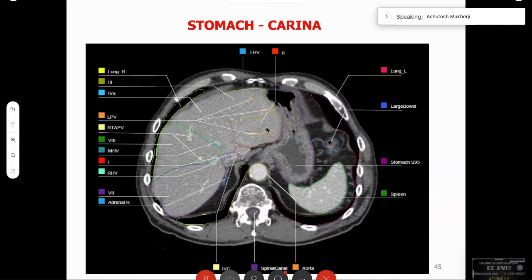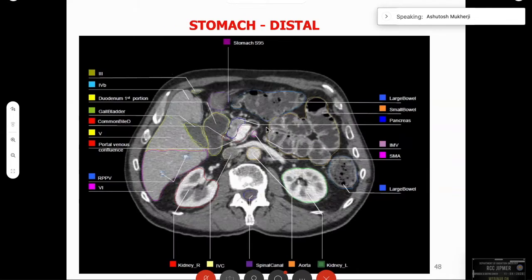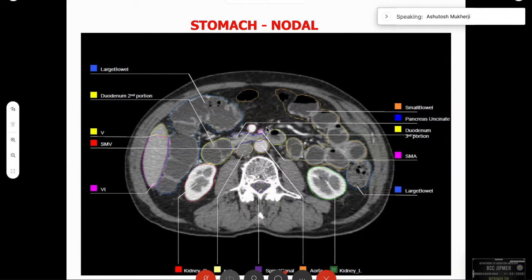There is a plethora of organs at risk near the cardia of the stomach and the proximal body of the stomach. As you can see the radiation fields through the stomach — going down into the nodal area, so many organs at risk are present. The tolerable dose for the liver should be below 20 Gy for more than two-thirds of the liver, or 25 to 30 Gy for less than one-third of the liver.